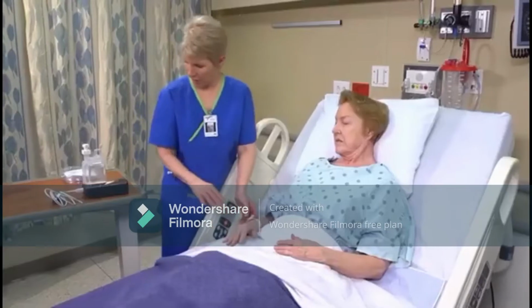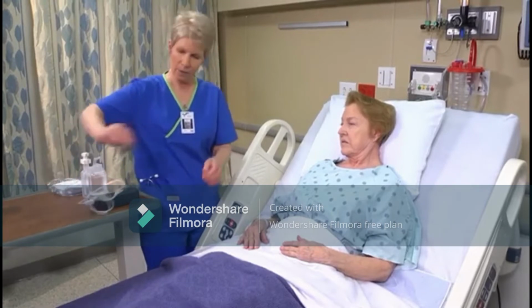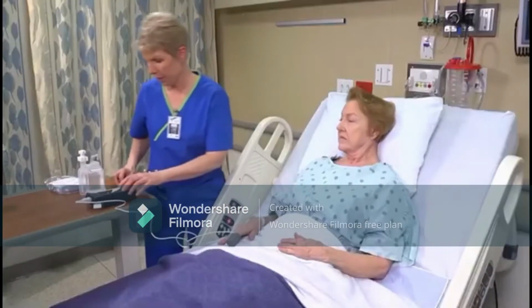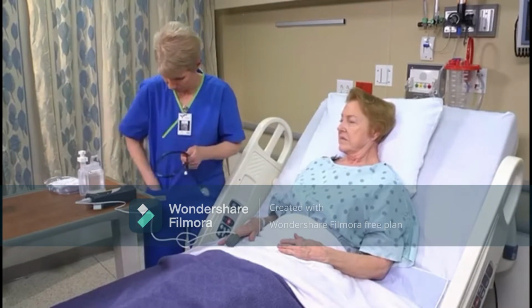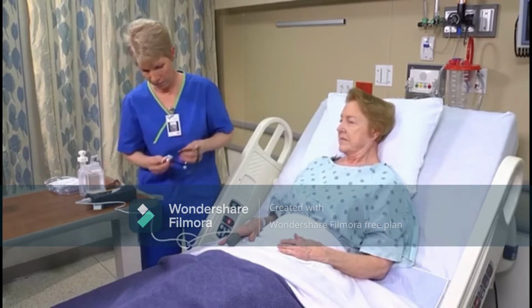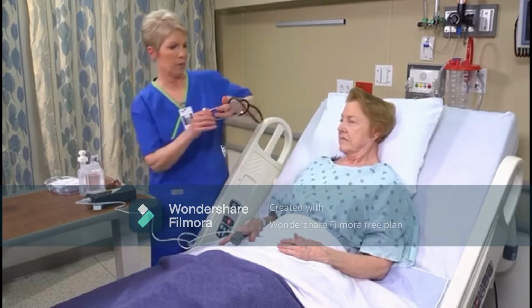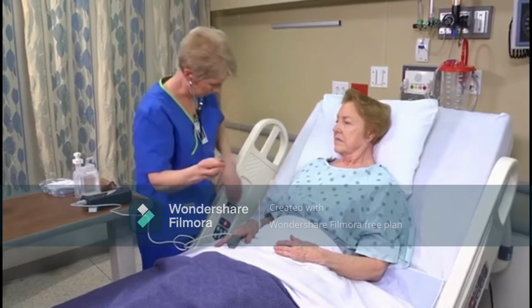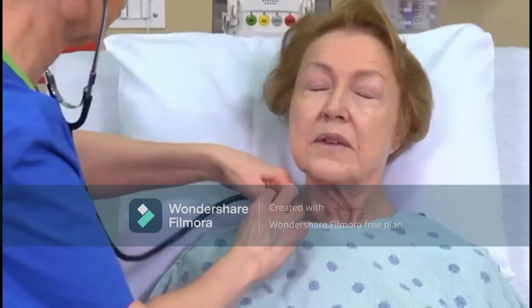Okay. I'm going to be checking your vitals because we have an order for some oxygen. So this is a pulse oximeter, and it's going to check your oxygen saturation. Then I'm going to listen to your lungs. Before administering the oxygen, assess the patient's respiratory system, including respiratory rate, sputum production, and lung sounds. Also, check oxygen saturation, or ABGs, if those values are available. Take some deep breaths for me.